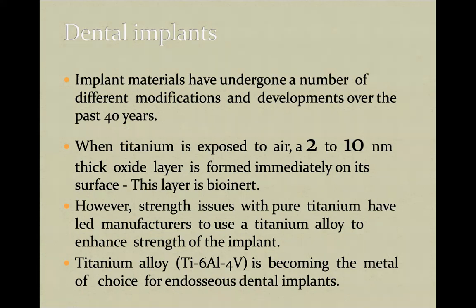And believe me, in my clinical practice, I'm frequently facing complications related to poor mechanical features of the dental implants, like fracture of the neck of the implant, or fracture of the internal screw, or fracture of the implant altogether.